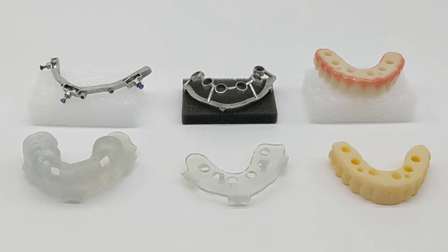This video will explain chrome guided smile components. With a few exceptions, the items you see here are the items that will be included on the day of surgery for a chrome guided smile case.